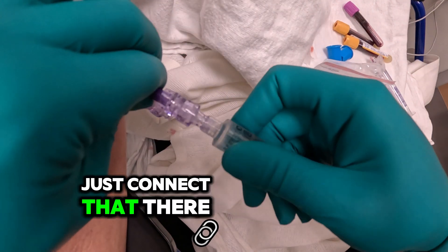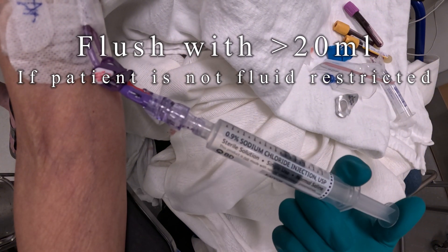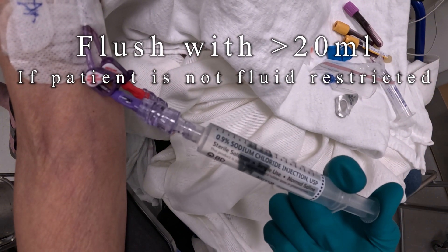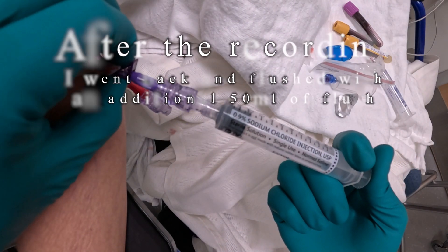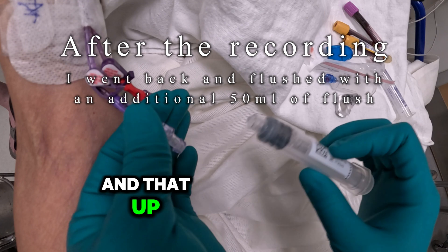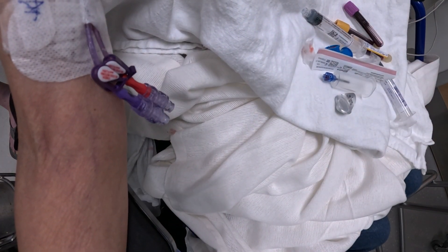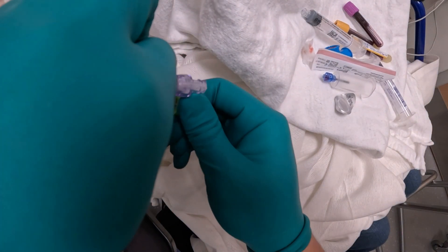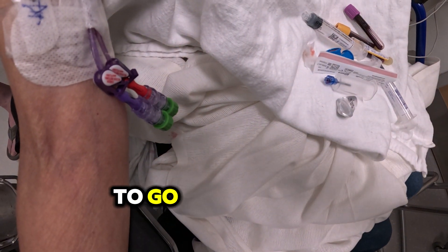Just connect that there, and now crank that up. Don't forget your alcohol caps. Patient is good to go.